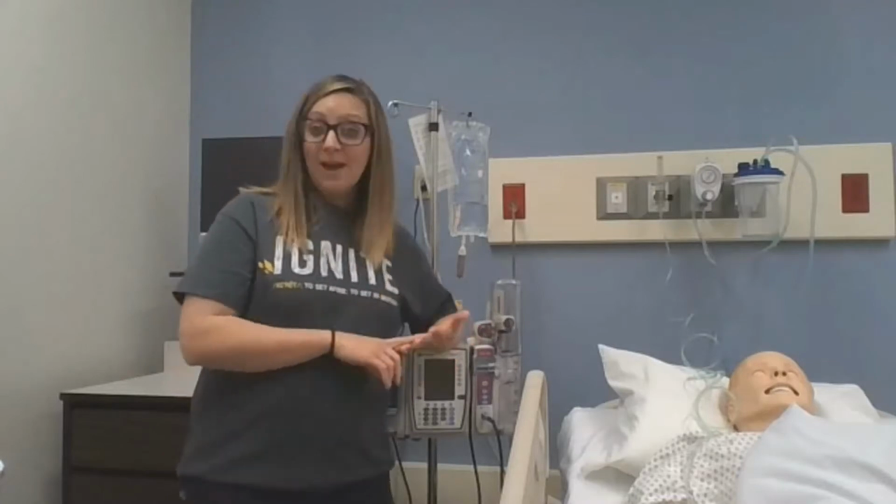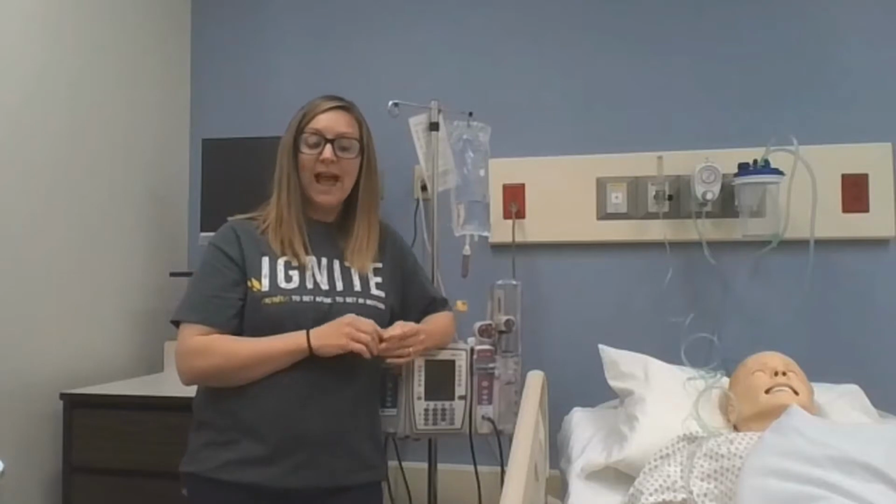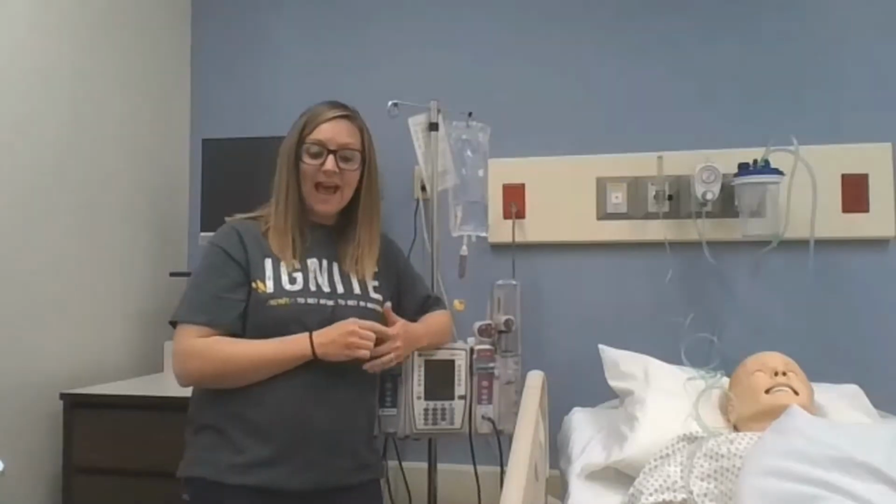So they also have to have continuous SpO2 monitoring. That's part of the power plan or the order set. So they're going to have a continuous pulse ox on them. So that's an additional line that they have.